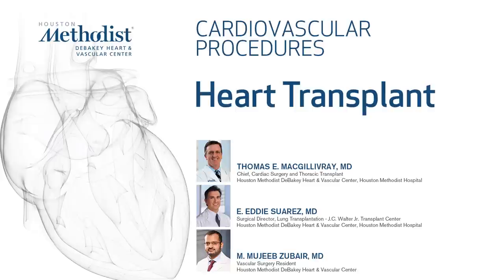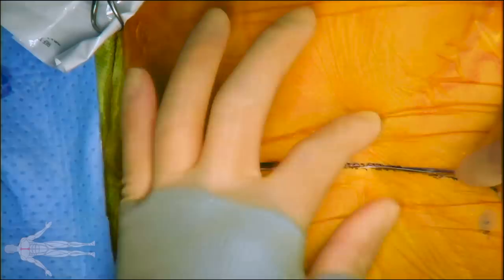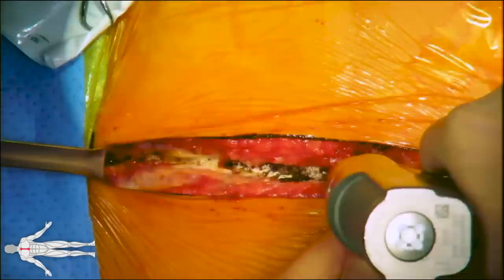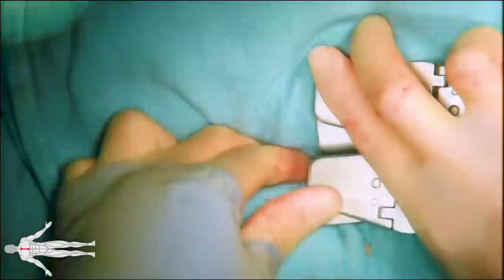This video demonstrates heart transplantation in a 41-year-old female who presented with acutely decompensated heart failure. She initially developed heart failure secondary to postpartum cardiomyopathy. A standard midline sternotomy incision is made, dissection is carried down to the sternum, the interclavicular ligament at the sternal notch is then carefully divided, and an electrical saw is used to perform the midline sternotomy. Next, a sternal retractor is then placed.